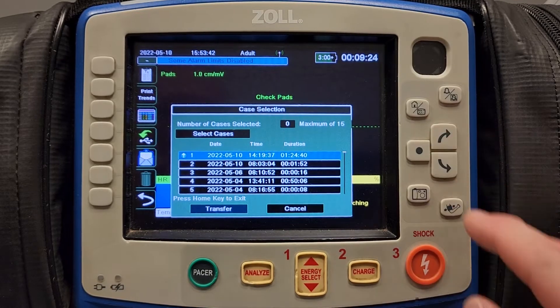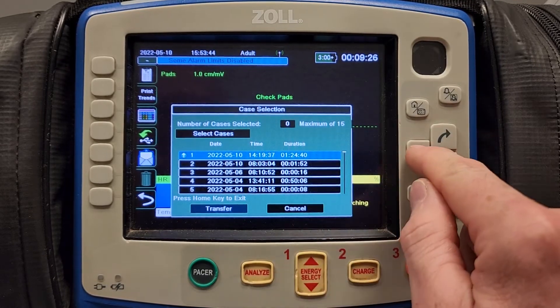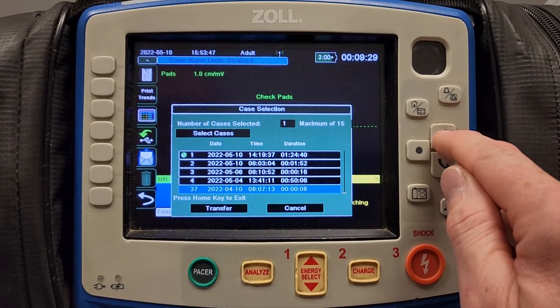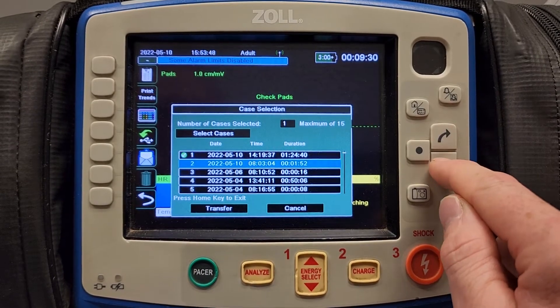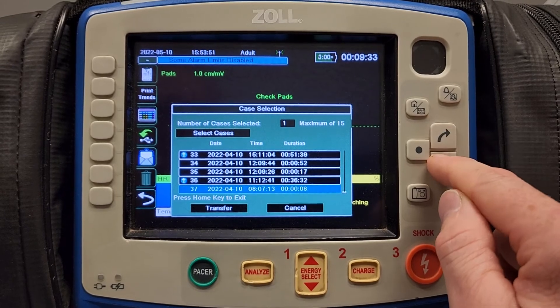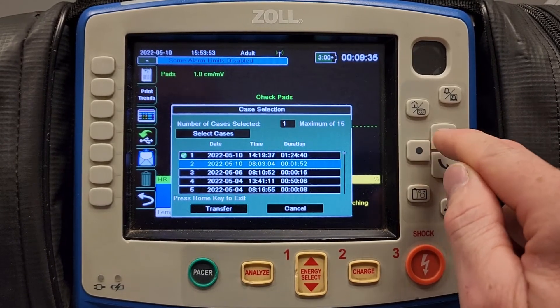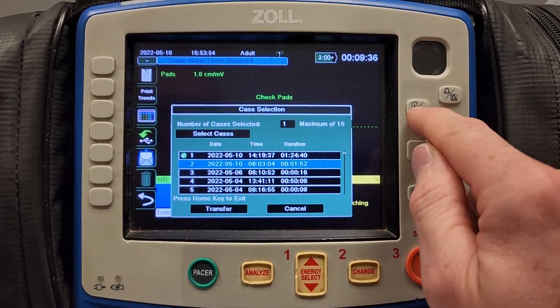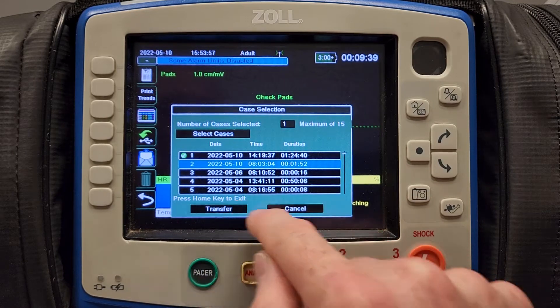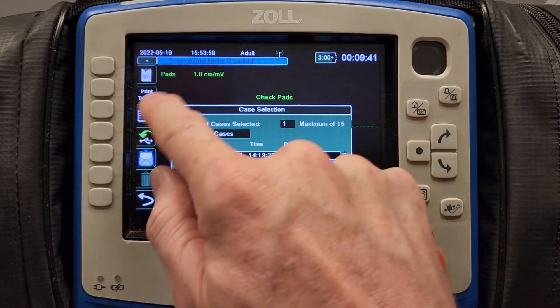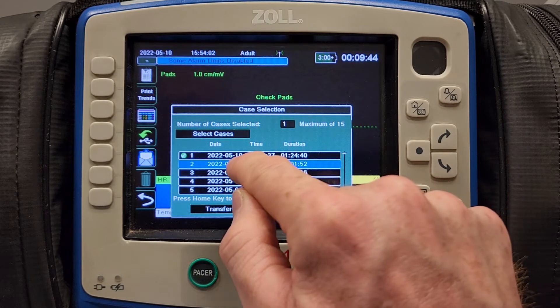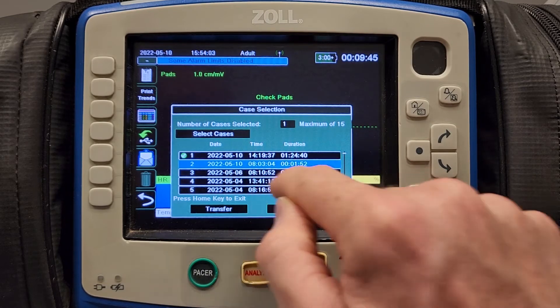The case on top is the last time the monitor was turned on — in this case, that is our patient. I'm going to select that to highlight it. To get out of the selection tab, you have to hit the home screen. It says press home key to exit — that doesn't exit you out of this menu, it exits you out of this selection process.